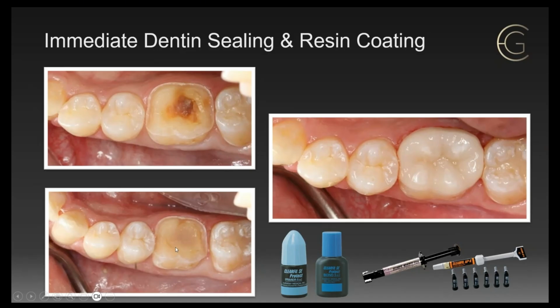This is from 2016. Keep in mind that we were told that the failure with the MMPs, the bond degradation, is going to occur at the 3 to 5 year mark. This patient comes in every 6 months, and we take photos. When I took this photo right before we were getting ready to let her go, I was really disappointed in my final restoration. And I said, Corin, I'd really love it if you'd let me do this over again.